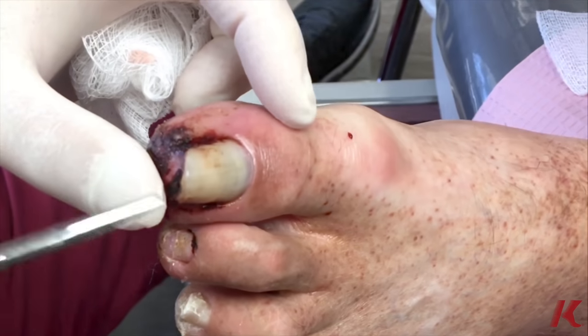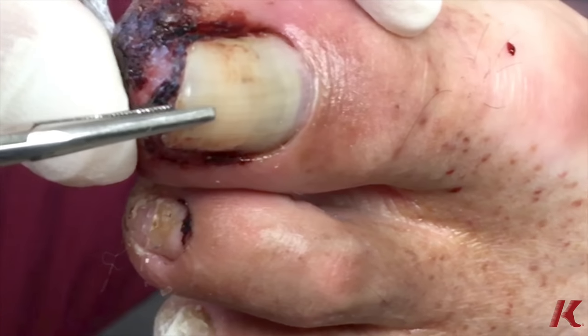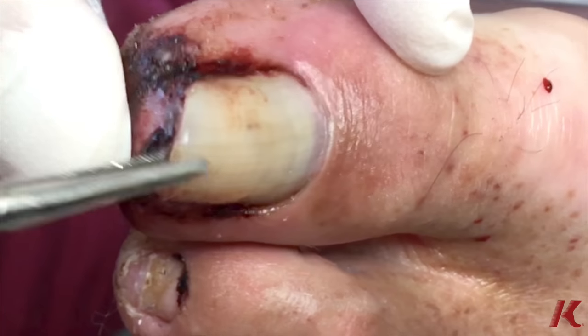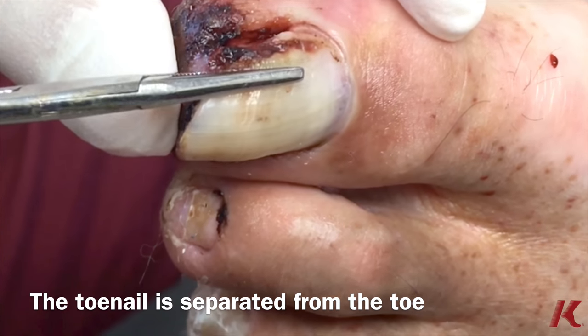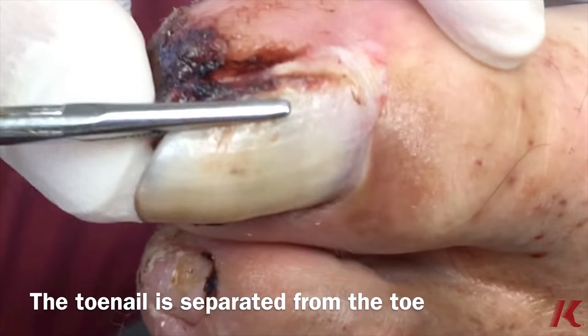We'll just take the hemostat and just kind of free it up from the nail bed. You can see most of the nail is actually physically separated — it's just attached at the base of the nail.